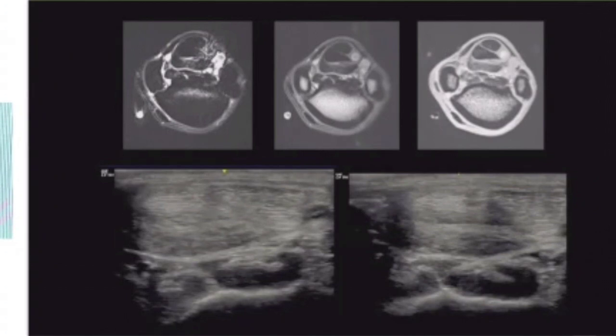And I actually went back to that horse and I had the MRI pulled up and I scanned the horse while looking at the MRI, trying to capture that, which is actually what this image is. And I still could never really recreate the amount of bone change on the ultrasound that we see on the MRI. But sort of more importantly, a relatively normal ultrasound on a lame horse gets an MRI and significant findings.